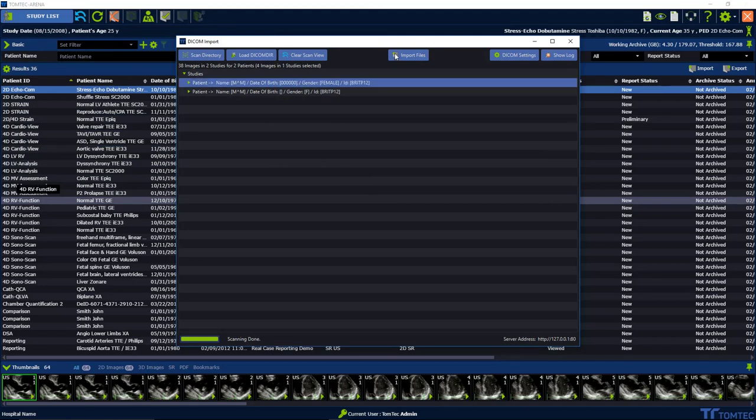Then click importing files. The application recognizes if the study is already imported and will give you a warning.